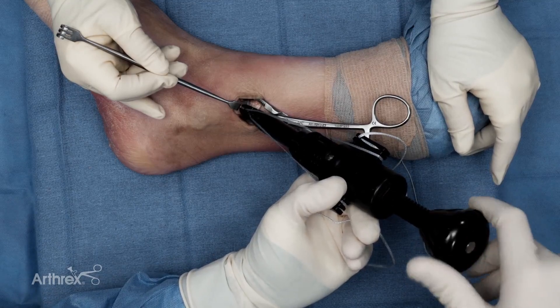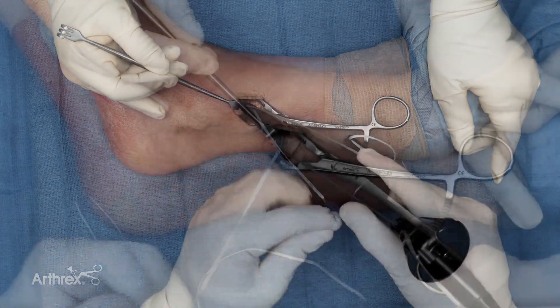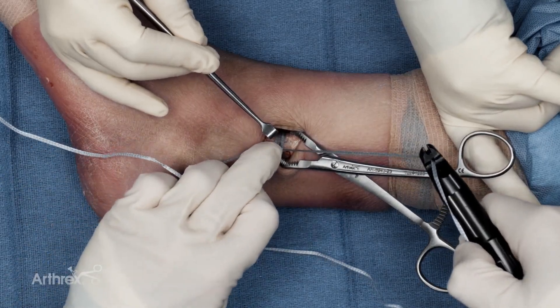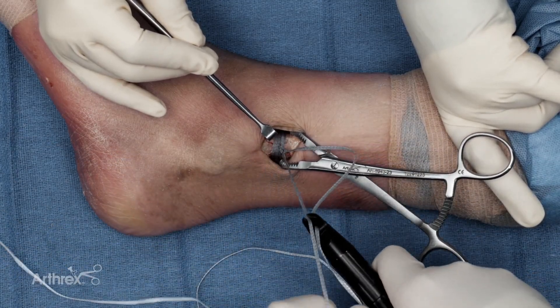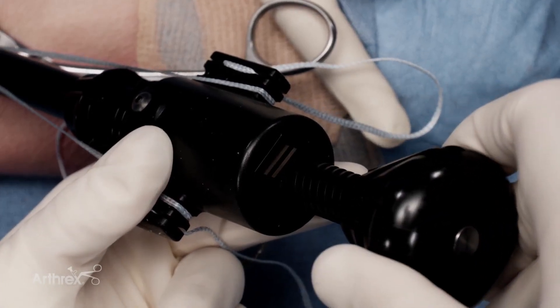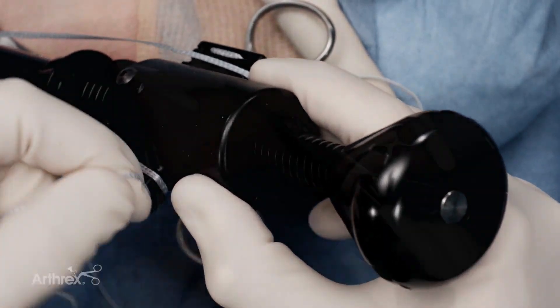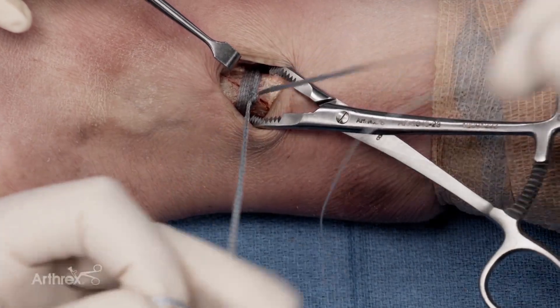I'm now going to release the tensioner by turning counter-clockwise and un-cleat the different limbs of the fiber tape cerclage. I've now gotten the amount of compression with the initial tensioning. I'm going to throw a knot — just a traditional half hitch — reduce it down to the racking hitch, and then re-tension one more time to make sure there's no more slack in the system. After tensioning down the half hitch, I'm now going to throw two more half hitches to secure the knot.